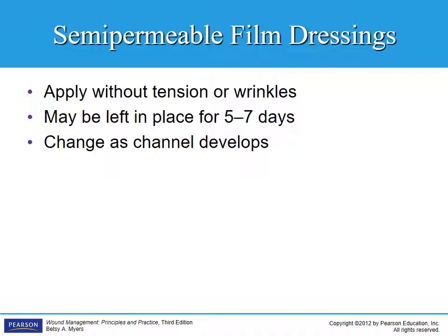As we talked about earlier, you always want to make sure you're not making wrinkles or creases, but also that you're not stretching them across the skin, because you don't want to cause tension underneath that dressing. The semi-permeables can be left in place for 5 to 7 days.